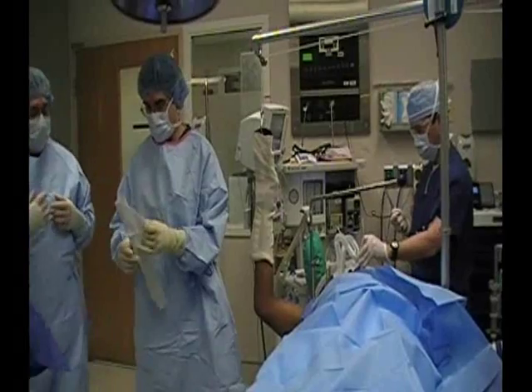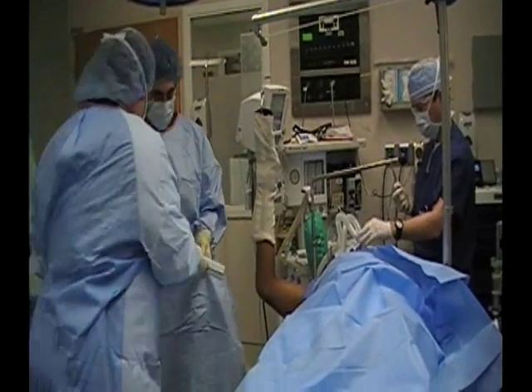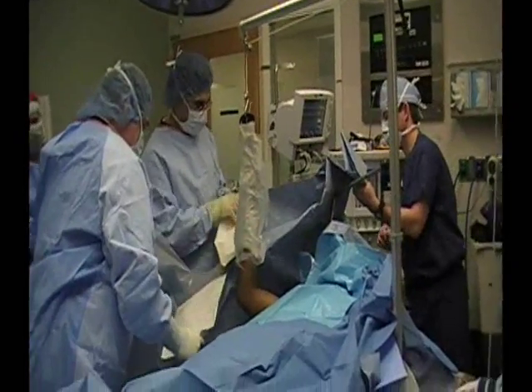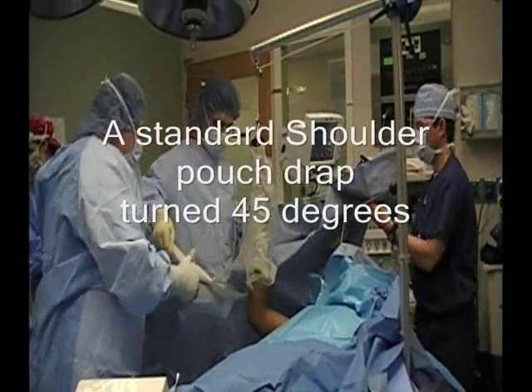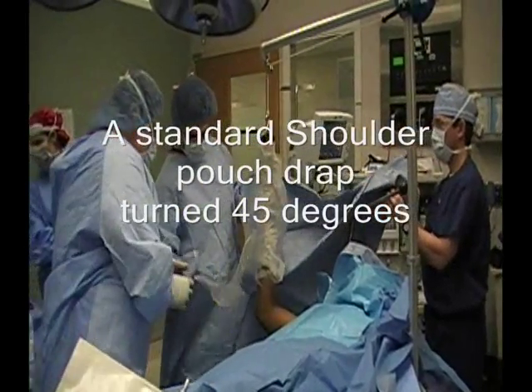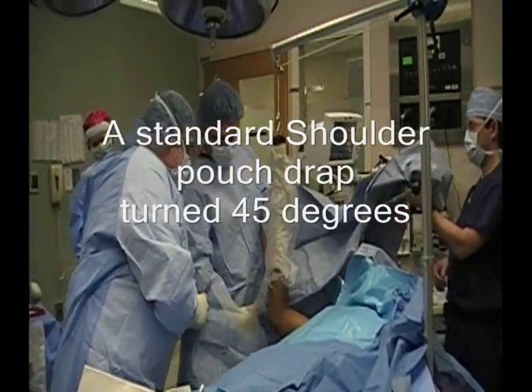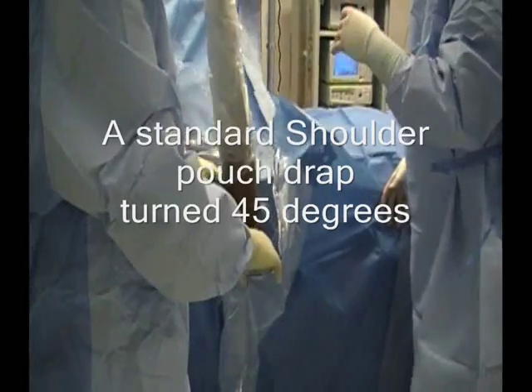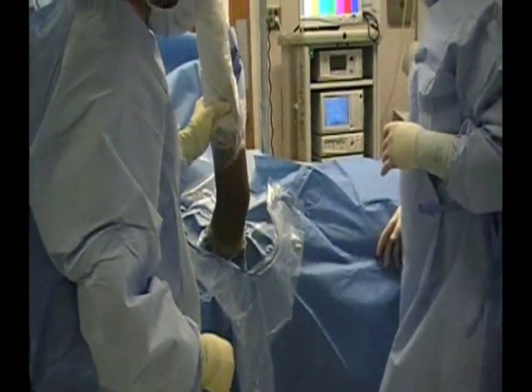Do you want to tie on that first? Do you want to come around this way to show the couch and the elbow? We haven't changed our mobility.